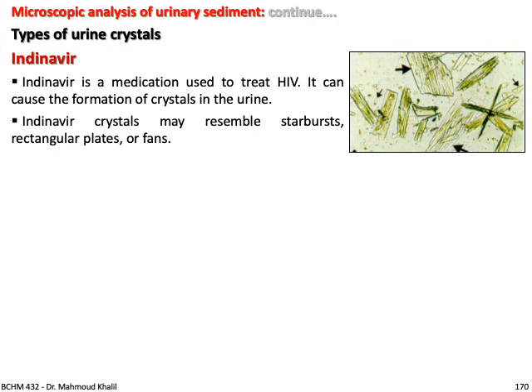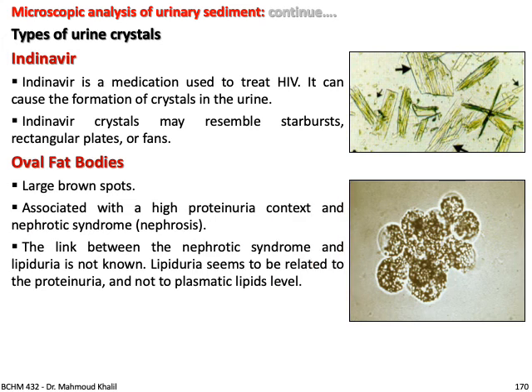Indinavir is a medication used to treat HIV. It can cause the formation of crystals in the urine, like the figure. These crystals may resemble starbursts, rectangular plates, or fans.